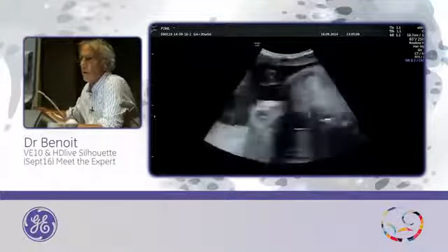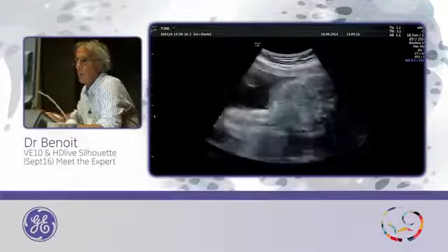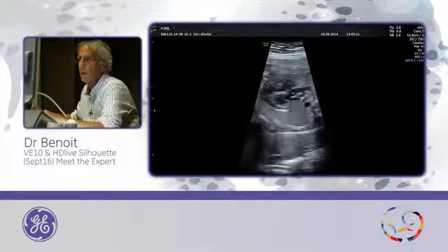So what else can I show? I think we can do a real-time 4D on the fetal heart when you have the four-chamber view. Yes, so I will go with the cardiac settings here. This is a cardiac setting.